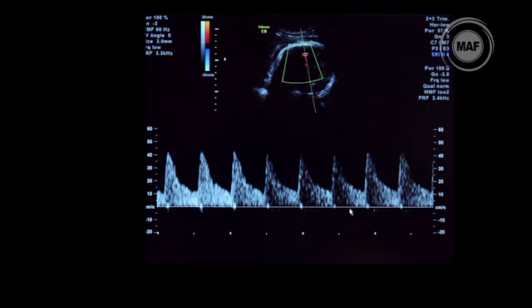Now you can see, even though the peaks on this middle cerebral artery are fine, you can see the difference. This is nice and bright. You can get the echoes through the whole spectrum. Here you're missing it, right? Okay. So again, you can do the middle cerebral artery.